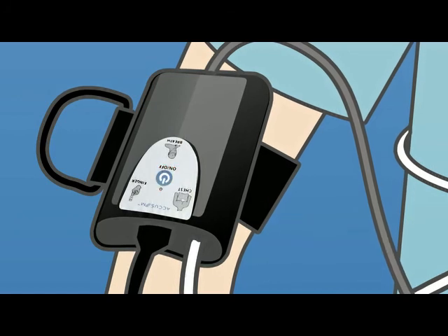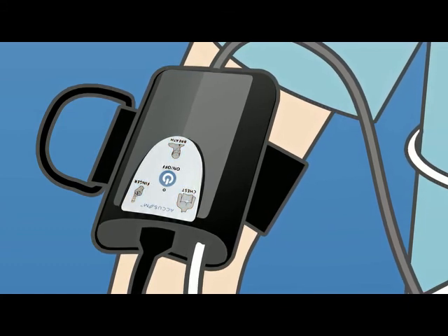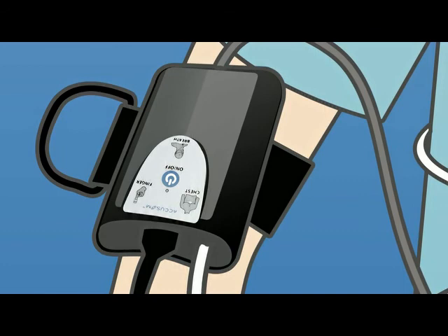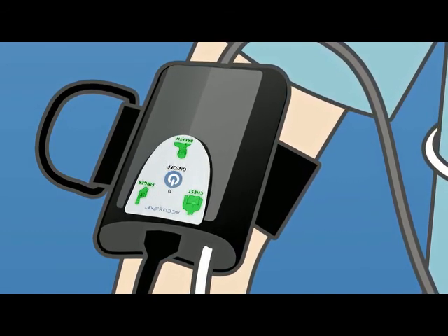The device will prompt you to check the sensors and the lights will flash orange as the device goes through its system checks. Once all connections are verified to be working, the lights will then turn green. The device will then announce: system is now recording.